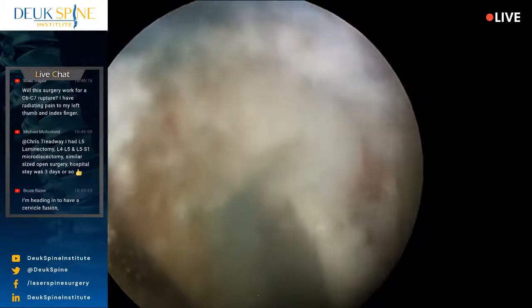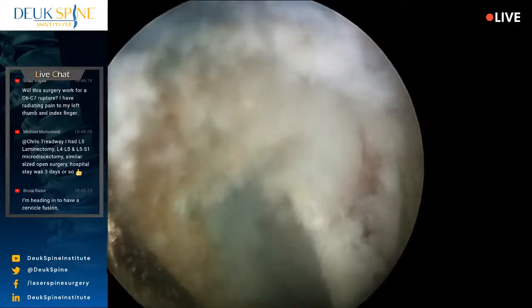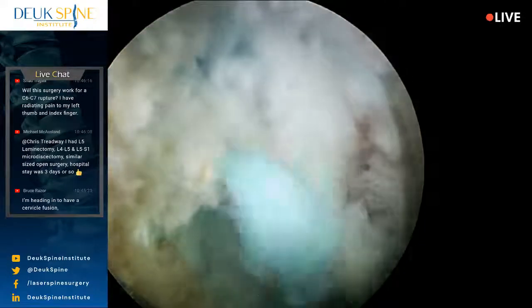All right, what is that there? Let's go grab her. So this is the disc that was listhesed. Remember, one bone was slipping forward on the other? So I think we're seeing a little bit of that right here.